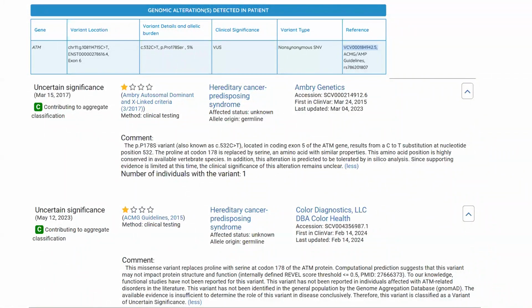Meaning, does it cause the protein to lose its function or not? That information is not available. Predictions are there. These are programs. These predictions, sometimes they say tolerated, sometimes they may say deleterious. So if they say tolerated, that's again an evidence to say that it is rare. So it's important for me to document. However, proline to serine is a tolerated change in the mutation. Since there is no further evidence on this, I am still keeping this information in the report. Maybe in future, there may be some more information that comes up.